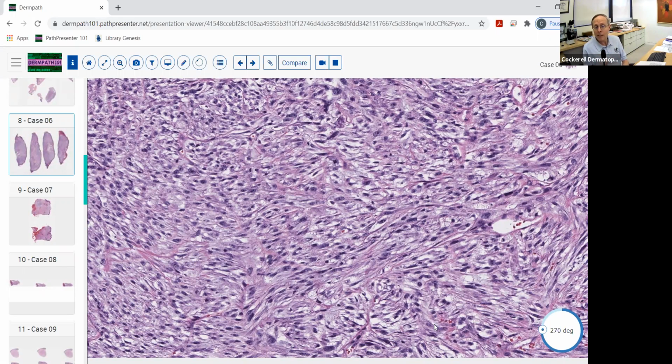And then for the actual fibroblasts and histiocytes themselves, CD10 is a good marker. And CD10 will stain other lesions, but this lesion, it stains very dark and very diffuse. So when it's negative for cytokeratin and maybe negative for SOX10, but strongly positive for CD10, that's the diagnosis then. You can make a definitive diagnosis.